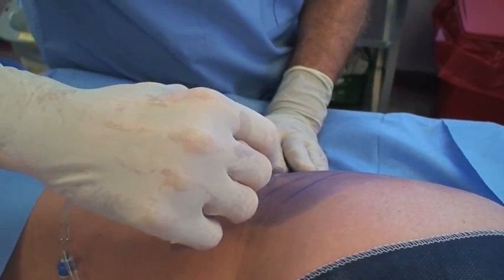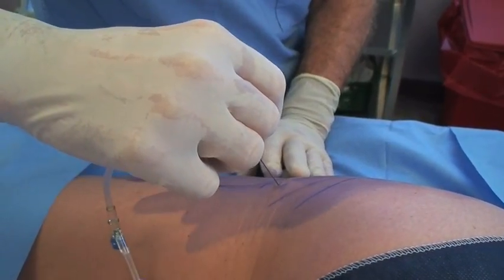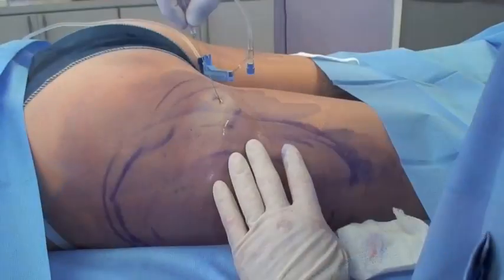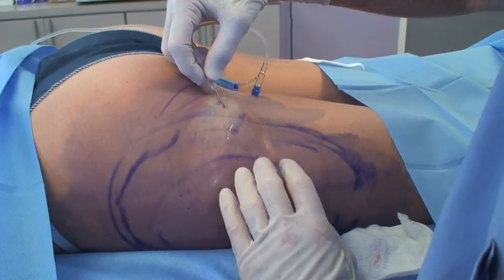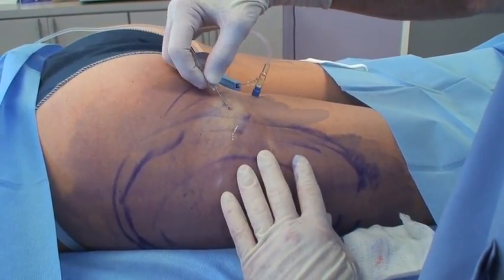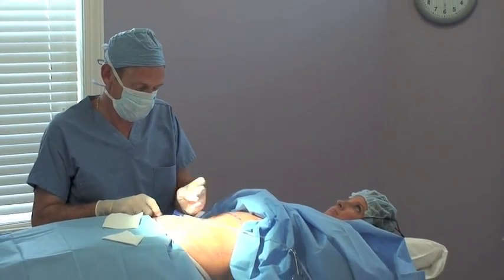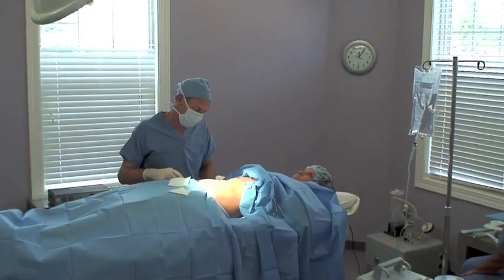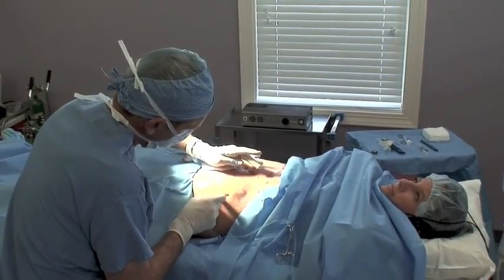The first step in the process is putting the tumescent fluid in the tissue. This is really the slowest part. This provides the anesthetic effect and also shrinks the blood vessels down so we don't get any bleeding and minimizes any bruising that occurs. We're going to be putting fluid in her abdomen — it produces a swollen area, and that's what tumescent means. It's firm and swollen, and that's what the tissue looks like once we finish.